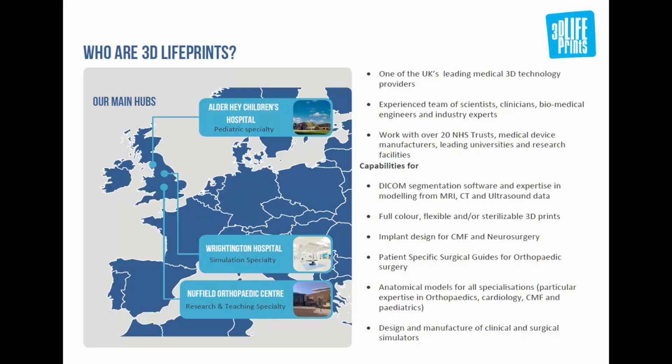So I want to give you all a quick overview of 3D LifePrints. 3D LifePrints is one of the UK's leading medical 3D technology providers. As I specified earlier, we take software, hardware, and staff, wrap them up in a package and put them into a hospital setting where our engineers can take patient data such as medical imaging, CT, X-rays, echo, and MRI, and turn those into accurate patient-specific models for all sorts of purposes and reasons that we'll talk about in a minute.